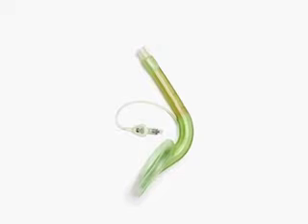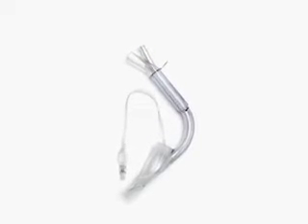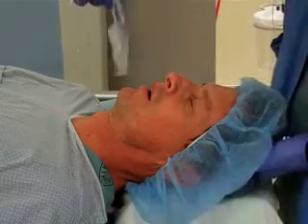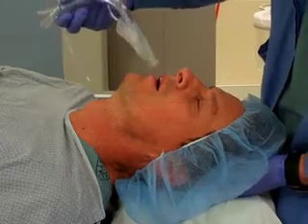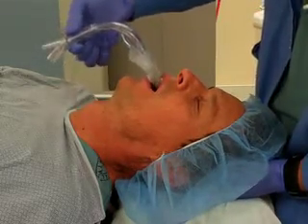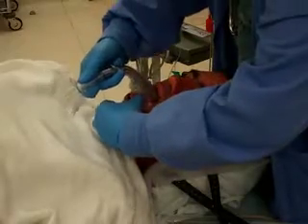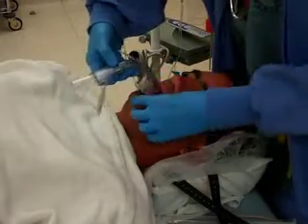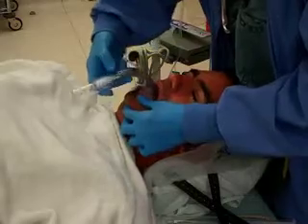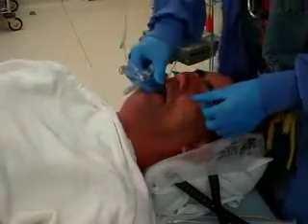Use of a pre-curved laryngeal mask airway sometimes allows placement without the need to insert hands inside a patient's mouth. To place a pre-curved laryngeal mask airway, grab the connecting tube with your dominant hand so the cuff points to the patient's head. Your hand should be in a neutral position with the thumb on the upward surface of the tube. As with the straight tube, guide the laryngeal mask airway above and behind the tongue by applying firm pressure along the patient's hard palate. Guide the tube behind the tongue and toward the larynx with a circular motion of the hand.